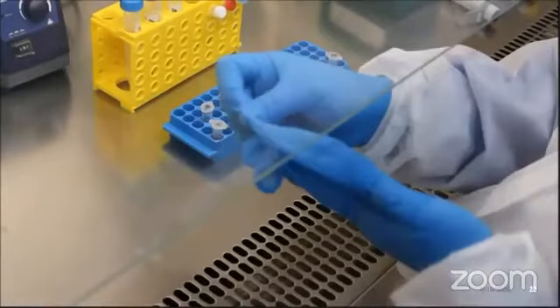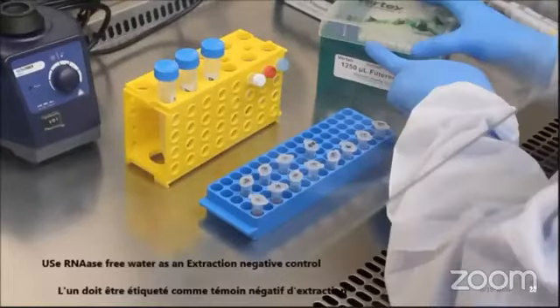It is advisable to remove the gloves after addition of the samples.